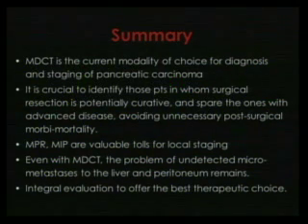Even with MDCT, the problem of undetected micrometastases to the liver and peritoneum remains. And remember, integral evaluation with multimodality assessment can give a better diagnosis and characterization. I think this is the last one.